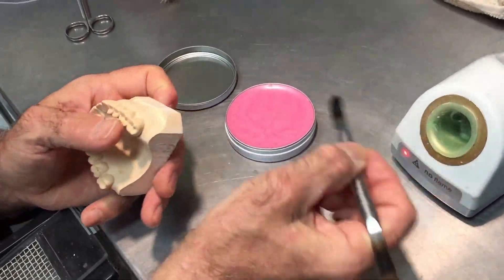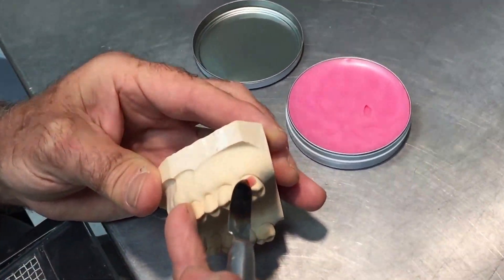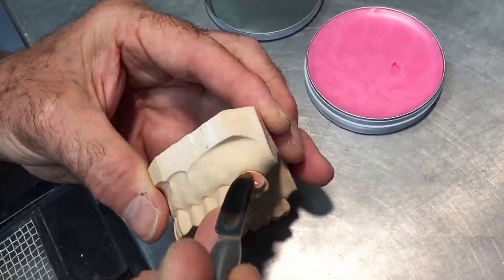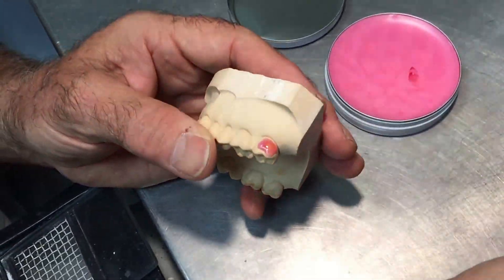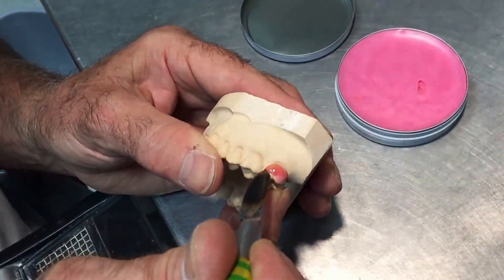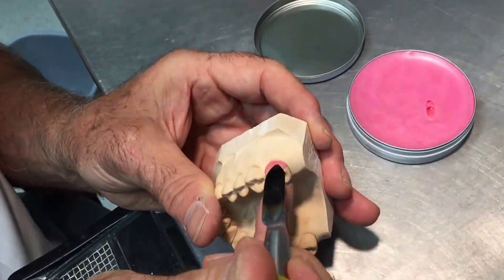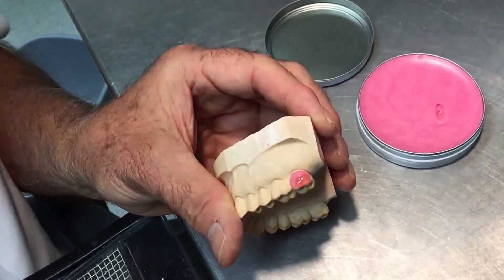We heat our wax, take a portion of it, and introduce it into the center of the tooth like so, then run it right out and get it as close as we can to where we want the bleaching to occur. I'm working on a molar here, and most patients would not want bleaching right back that far. The general rule is that we only bleach where we've discussed with the patient, or where you as a practitioner expect to bleach those teeth.